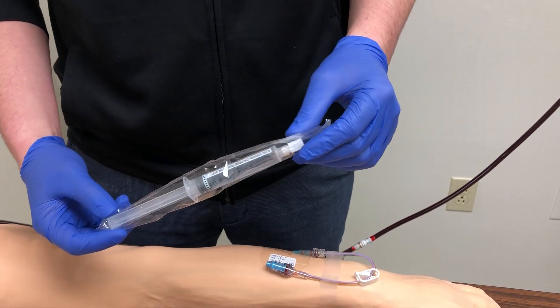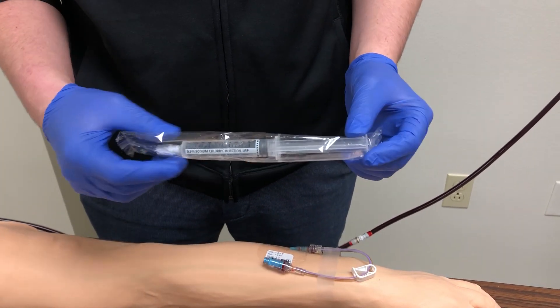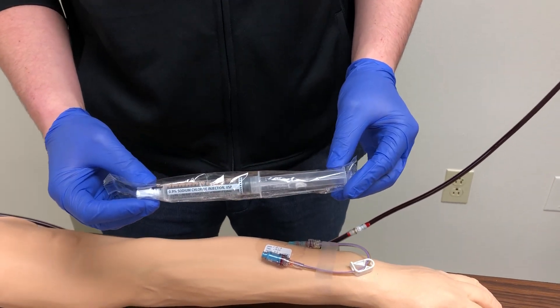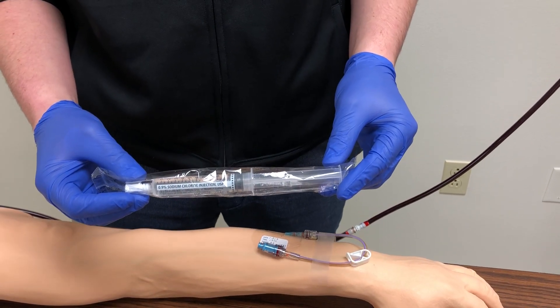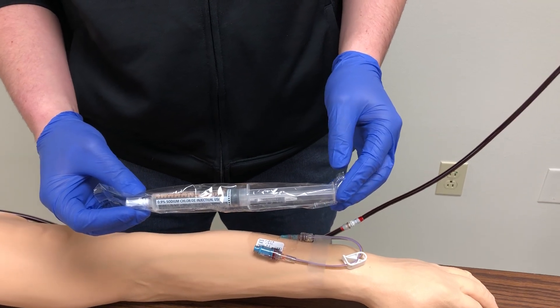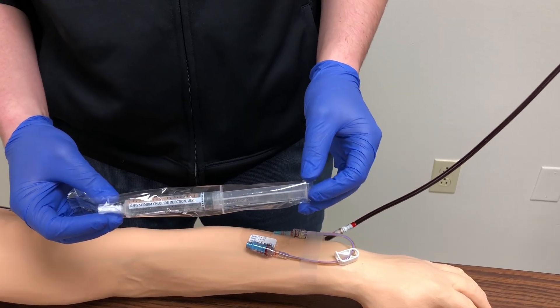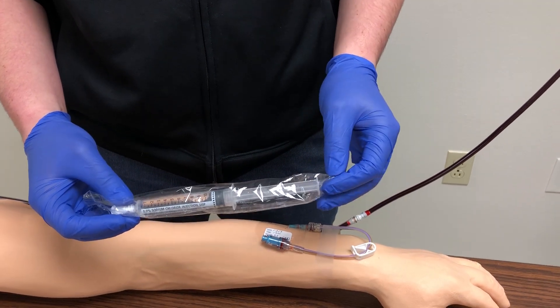Also remember that saline flushes are one-time use only. We have 10 mls in this pre-filled syringe. The order on the EMAR will read 'flush with 10 mls,' so we can use up to 10 mls to flush an IV. If we use less than 10 mls, we want to discard the remaining solution and discard the syringe appropriately.